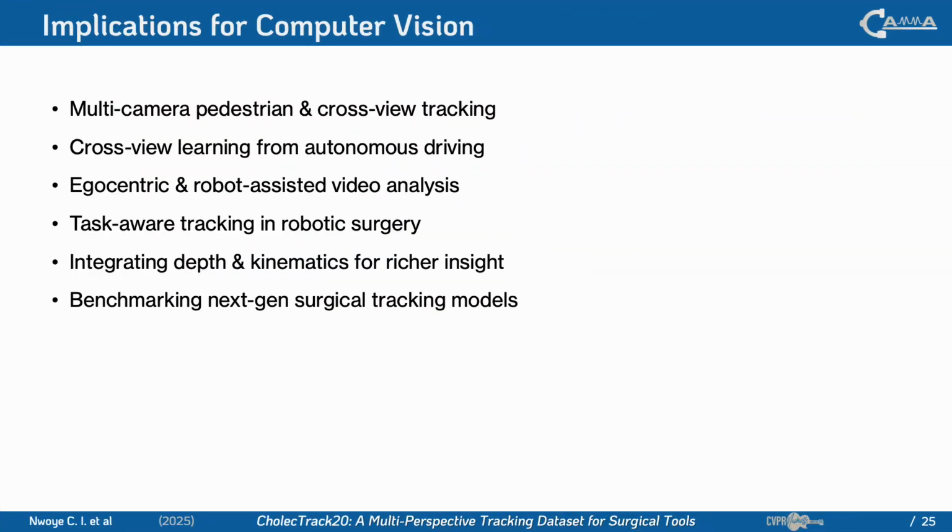This dataset highlights the limitations of existing tracking paradigms and the urgent need for more intelligent, multi-cue approaches. CholecTrack20 offers the right foundation to drive this evolution.